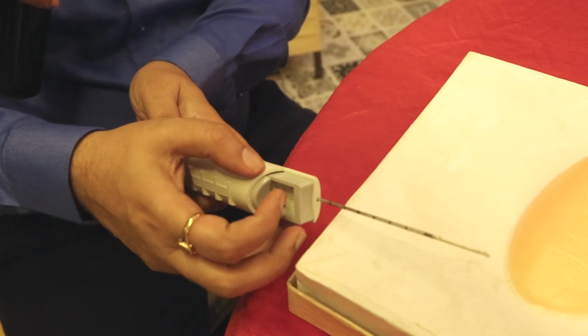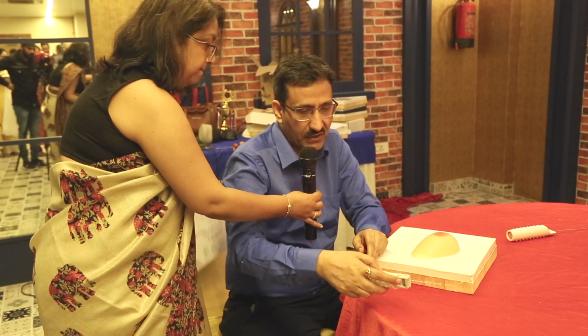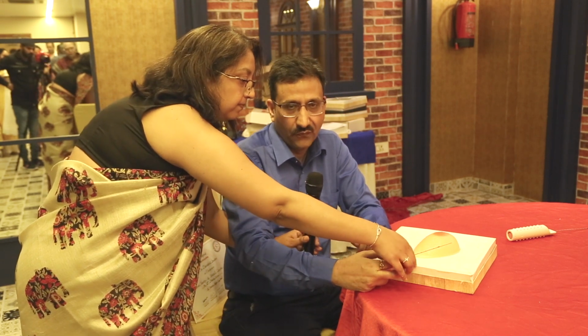We will have a sample here. Then we give it to the sister. She will put it into normal saline. The one which floats is not the right sample. The one which sinks, that is the right sample.